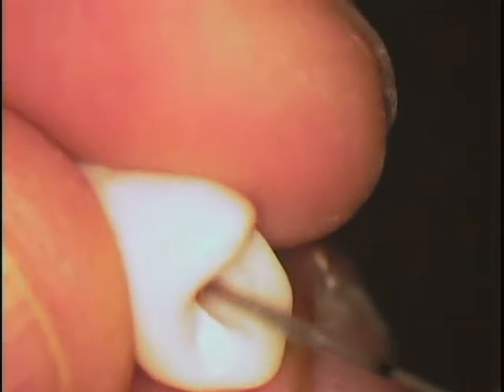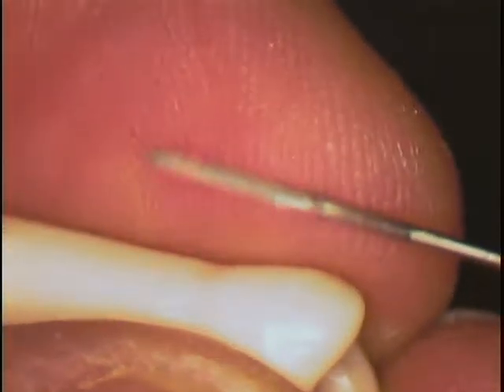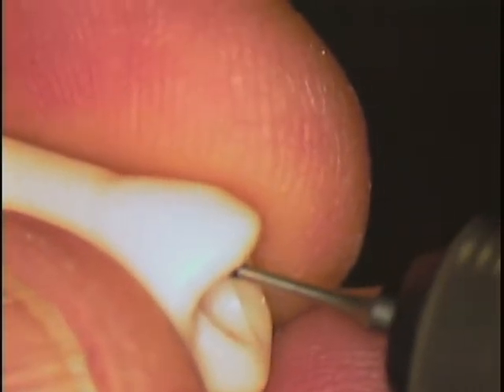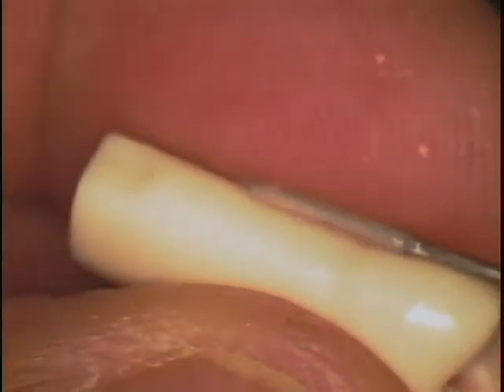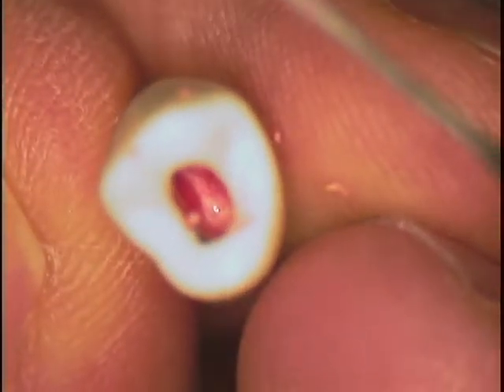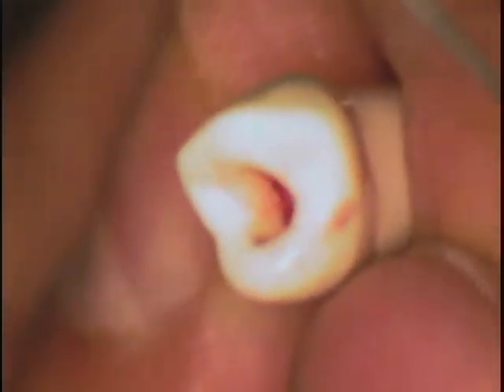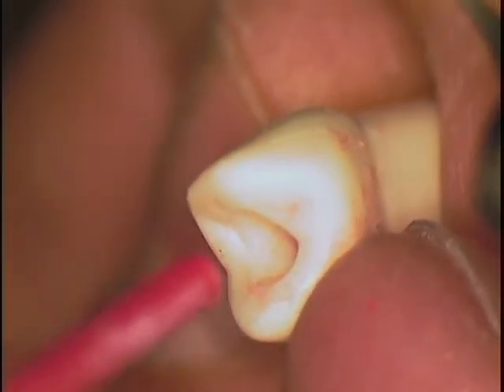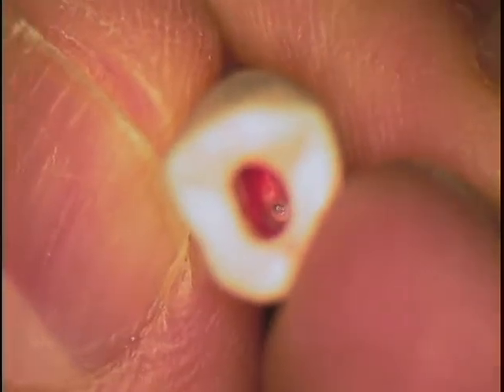Lingual canal again. All the way in. So you're passing it down right about here. I'm going to go a little bit further. I like 14. Okay. That's well lubricated. Just try that again. Go right in there with the tip. Yeah, there you go. Okay, you can see I'm going down that way. All right. Now the last thing you're going to use is the post drill.